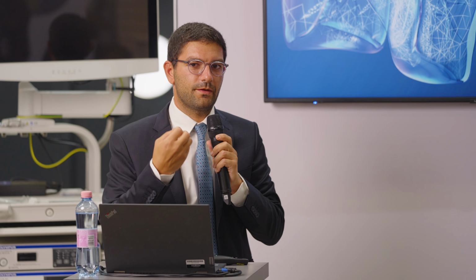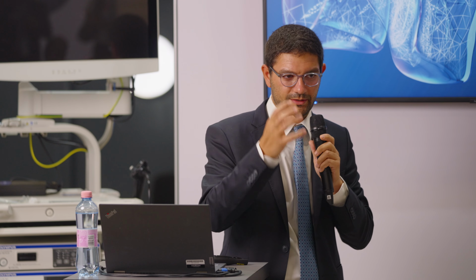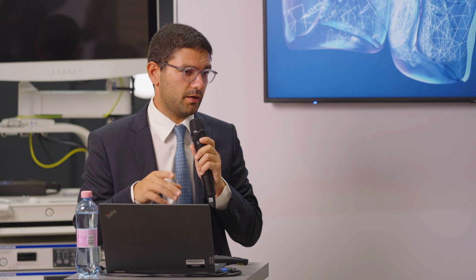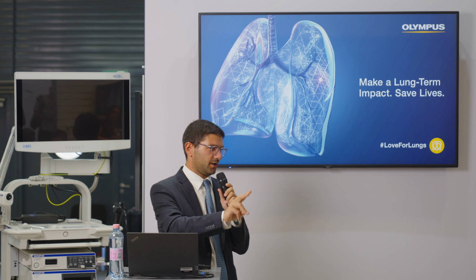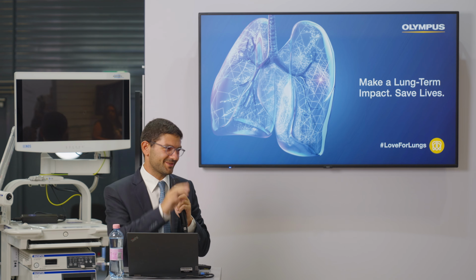But for now, I don't think your directors would accept to have a CBCT dedicated for the IP. But you can have the mobile C-arm, and it works very well as well. So I would choose the Ultraslim, the radial probe, and the cryo, if I have 3 tools.